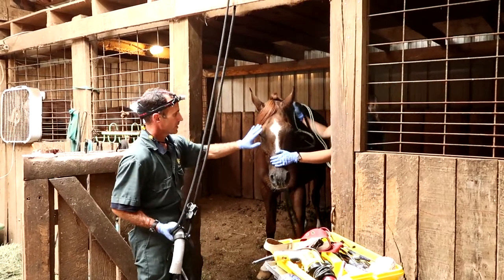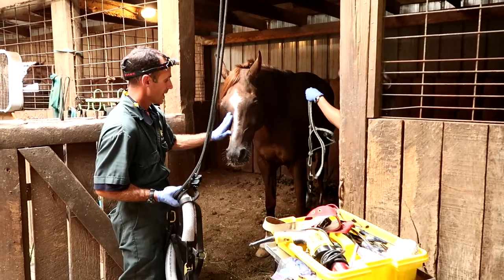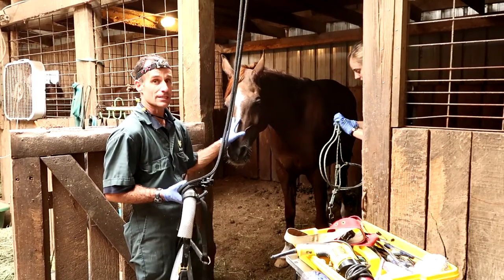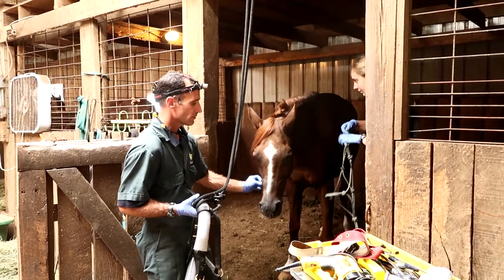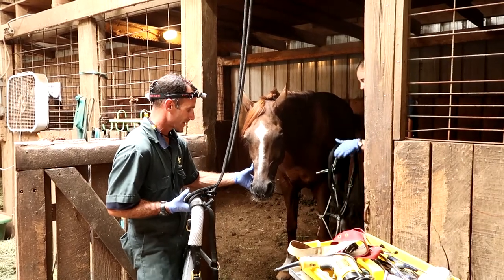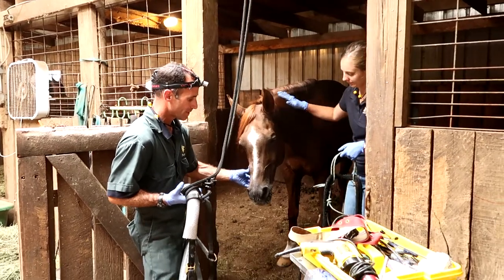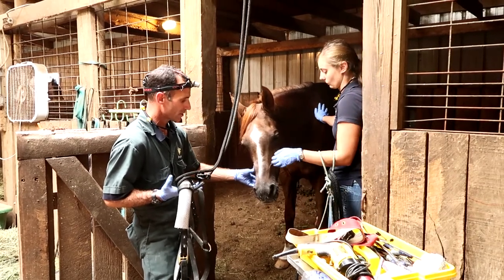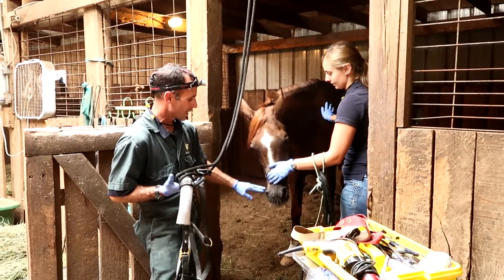The nice thing about being able to use sedation with our dentistry is that we have the opportunity to put a nice oral speculum in the mouth, giving us good access so we can visualize and actually palpate every single tooth in the horse's head. You can't recognize the ailment or the challenge when it's hard to visualize, so we take pride in being able to see exactly what we're doing and causing less soft tissue disruption through good visualization and sedation. It gives us the opportunity to perform those services with greater precision.